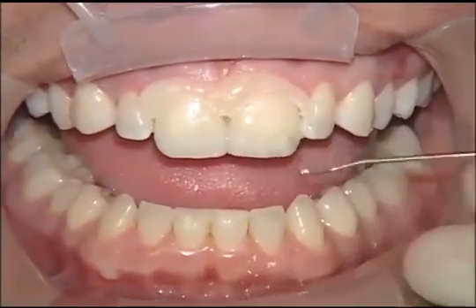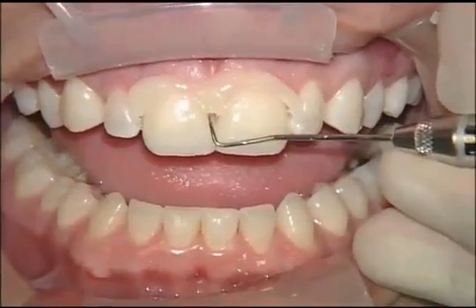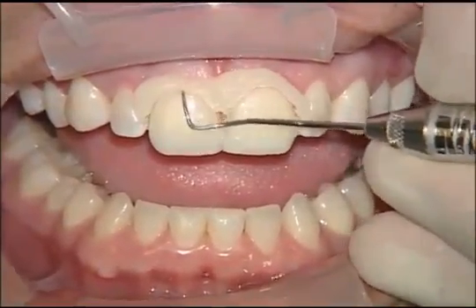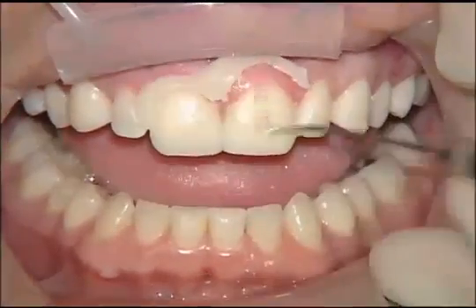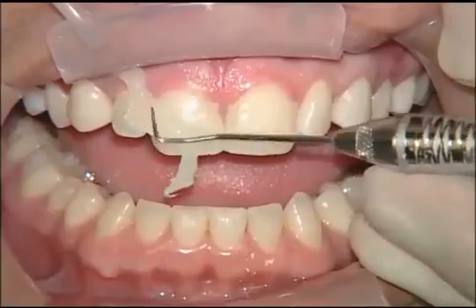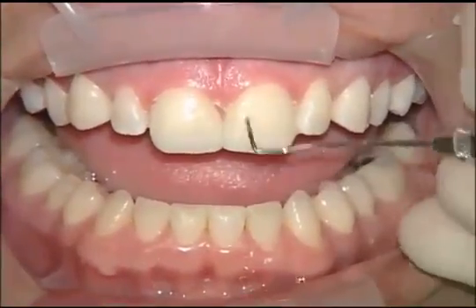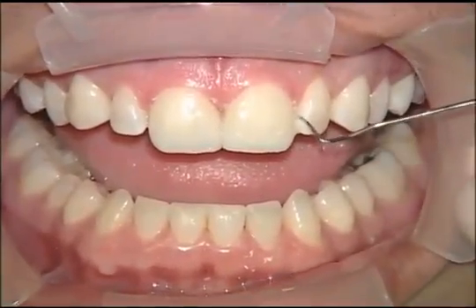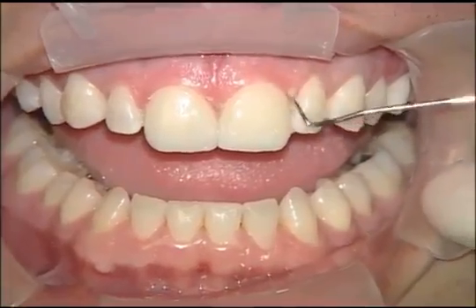In this case, we're doing veneers, and veneer cleanup is typically one of the harder things we do in general dentistry. And this tack and wave technique of removing this entire piece of cement at one time, as we've done here, really makes things a lot easier. Once we remove this large piece, we can then take the Explorer and go around the margins, check in the gingival embrasures as we're doing here, and remove any other excess that's there. But certainly the ability to remove that large piece right at the beginning saves us a ton of time with cleanup as we go through this.